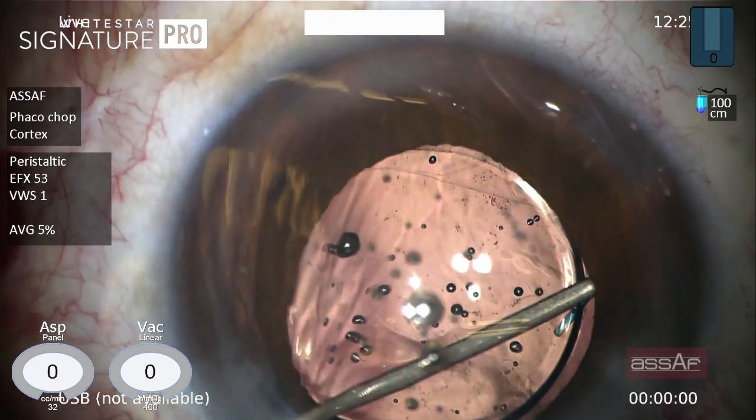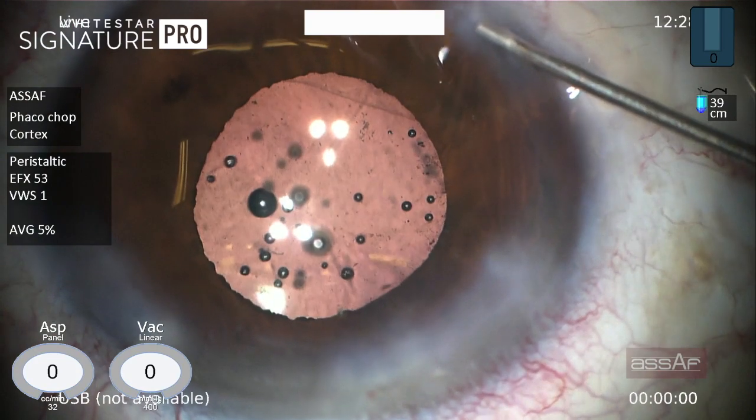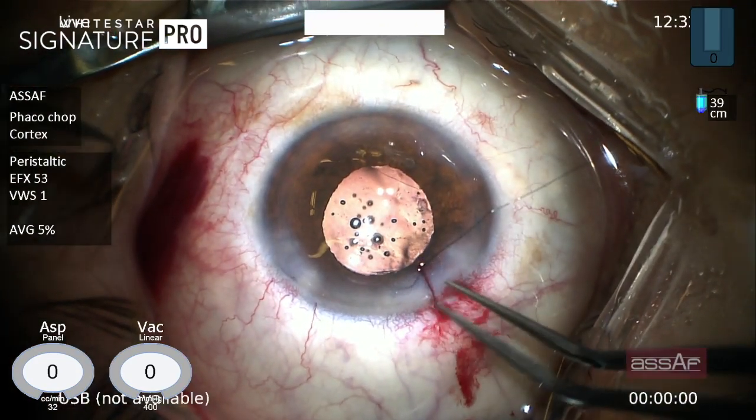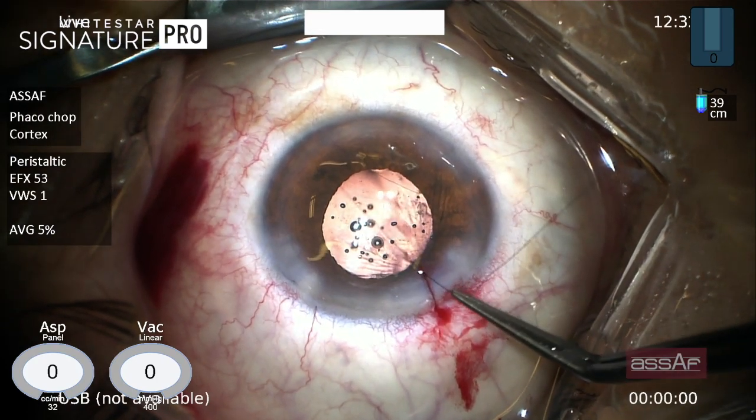Injection of acetylcholine to bring the pupil down. Stromal hydration for the main wound and side ports. And closure of the main wound with a 10-0 nylon suture as a safety measure. This suture can be removed a few days after surgery.